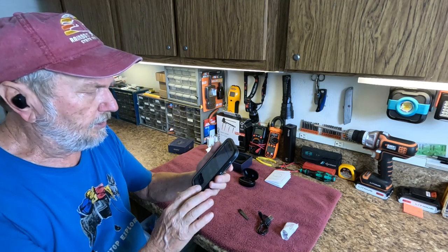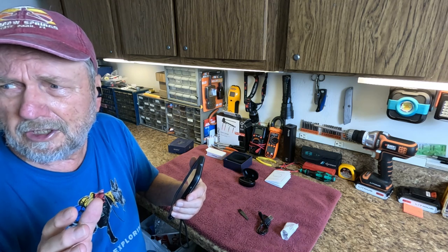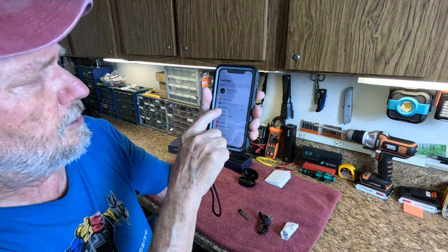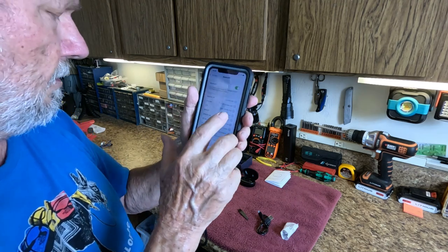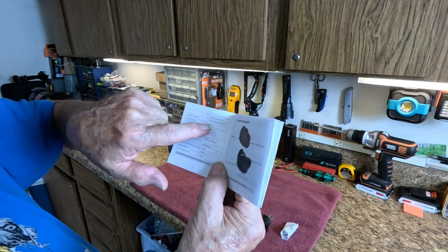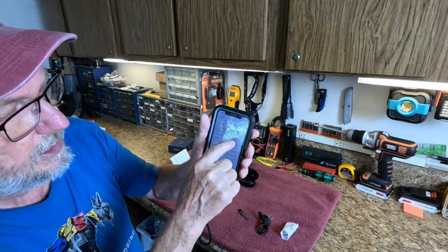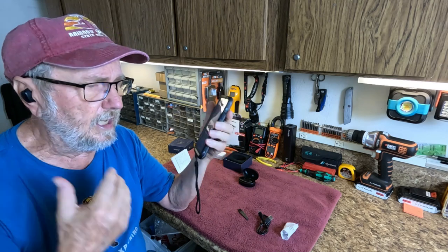They automatically pair with any Bluetooth device that's around like your cell phone. Go to your settings, then go down to Bluetooth and make sure it's on. The Bluetooth name is M-U-A-M-A-B-T - that's what you're looking for in your device list. There it is and it's already connected. It should automatically pair and connect if you have your phone on and close by.